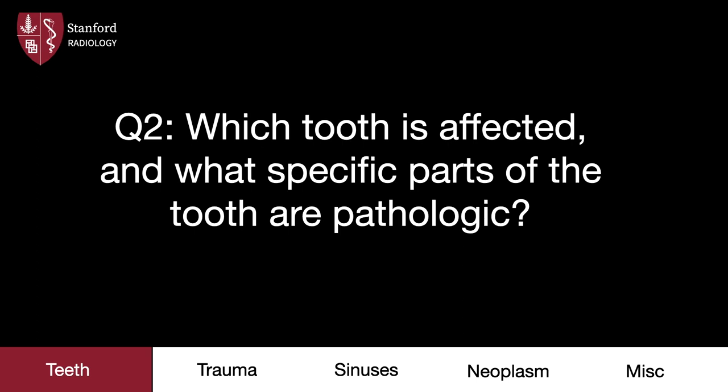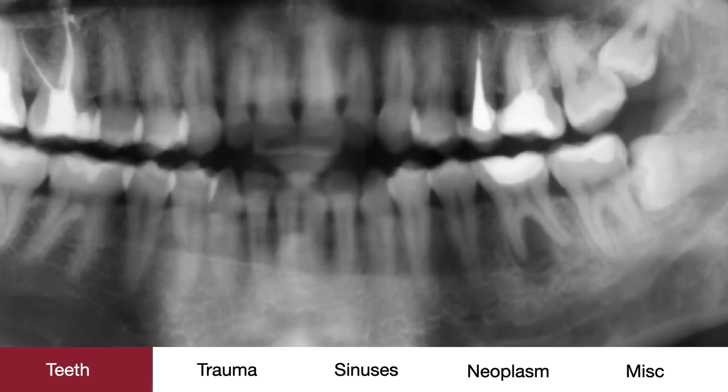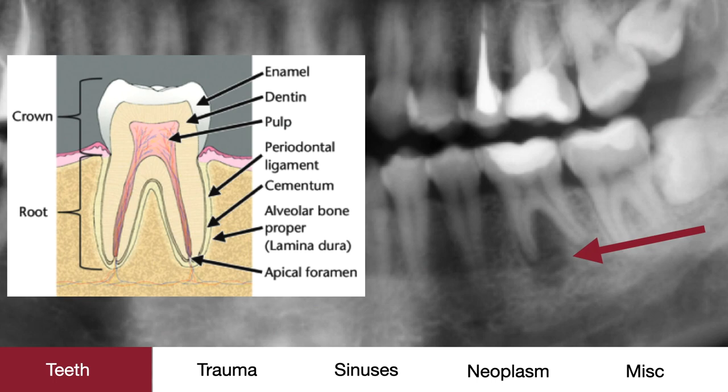For our second case, again identify which tooth is affected and which specific parts of that tooth are pathologic. Like the last case, the maxillary dental row demonstrates no acute abnormality, but one of the mandibular teeth does. Zooming in, we see that a periapical lucency surrounds the left first mandibular molar; the lamina dura and alveolar bones are lost. These findings overall represent a periapical abscess.